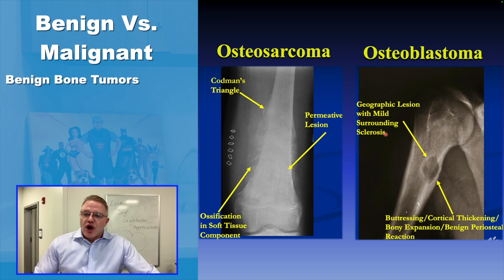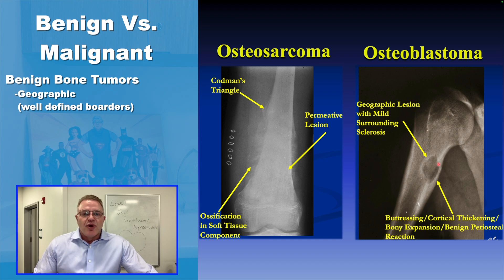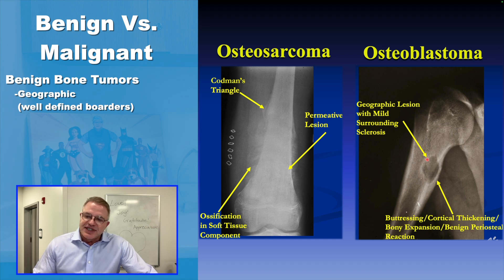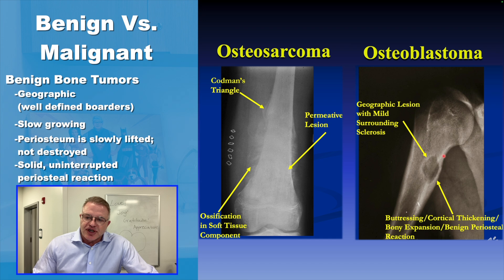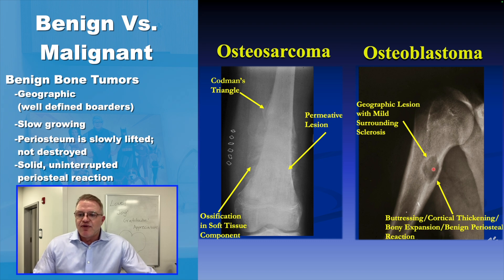Benign tumors are geographic in nature, meaning you can tell the borders of the tumor — where it begins and ends. Here we see an osteoblastoma, which is a benign bone-forming tumor. It is geographic, with a sharp, narrow zone of transition between the tumor and normal bone; you can make out where the tumor begins and ends. The tumor can destroy the cortex, but it grows much slower than an osteosarcoma — slow enough to stimulate osteoclasts to eat the bone. It does not penetrate through the Haversian canals. When it penetrates the cortex, the periosteum is lifted up but not destroyed, giving you a solid, uninterrupted periosteal reaction. You might see a little mineralization in an osteoblastoma, helping place it in the bone-forming tumor category.